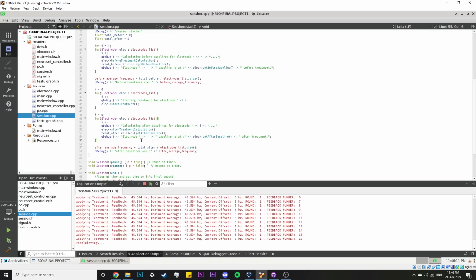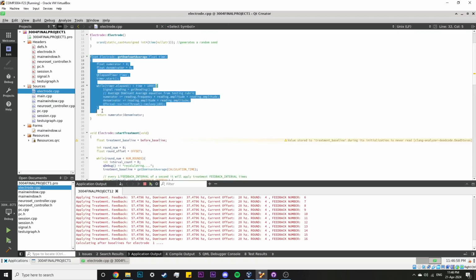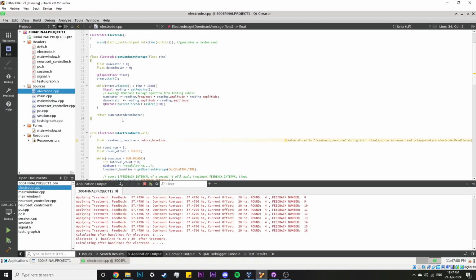So if you could go to the electrode class, start treatment, it goes for 4 rounds. It does the get dominant average according to the average equation in the testing rubric.